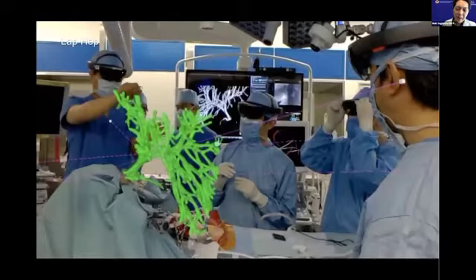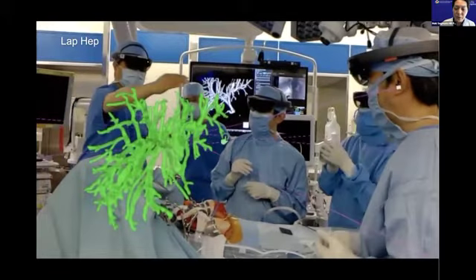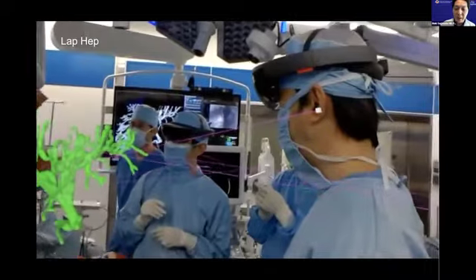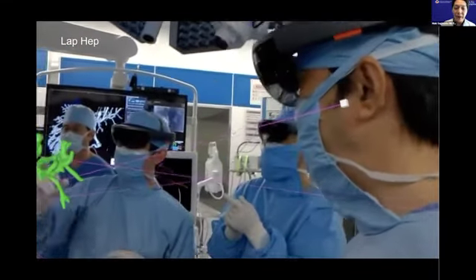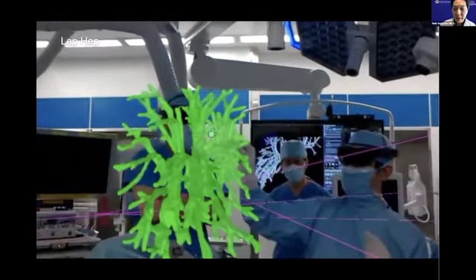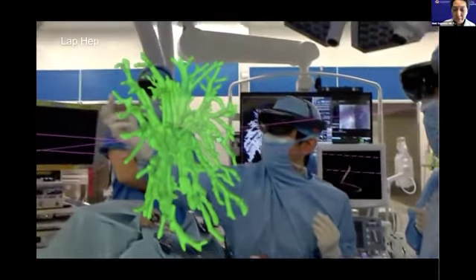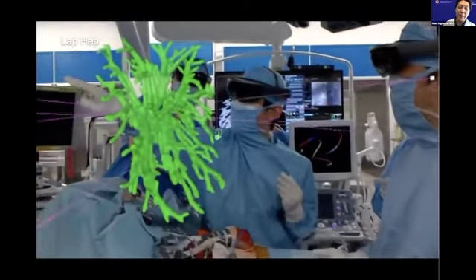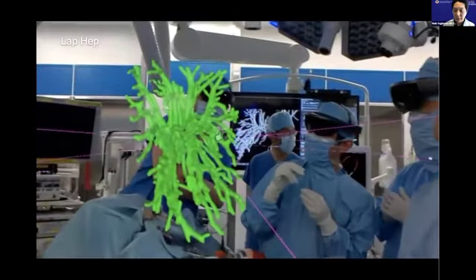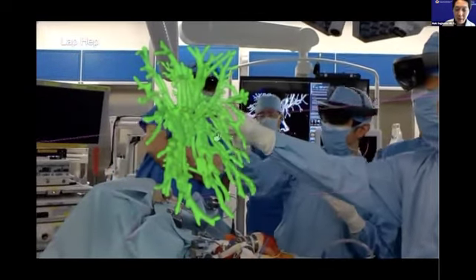This patient has an IHBD cancer, and during surgery, we could put the needle into the cystic duct and put in contrast material during the surgery. We can take a CT scan during the surgery, and we can reconstruct this data within 10 minutes. After 10 minutes of reconstructing the biliary duct 3D structure, we can see it in the patient's body, onto the patient's body during the surgery. We can select the margin of the liver.